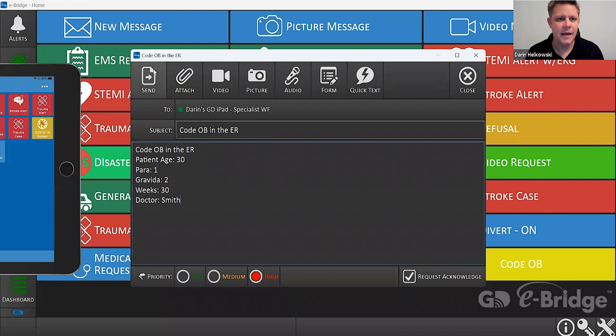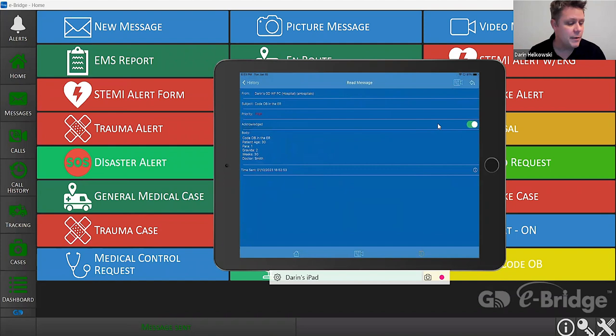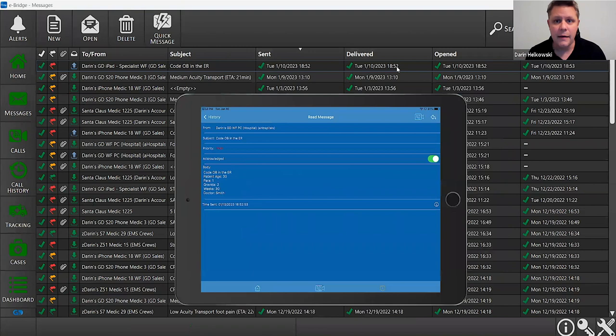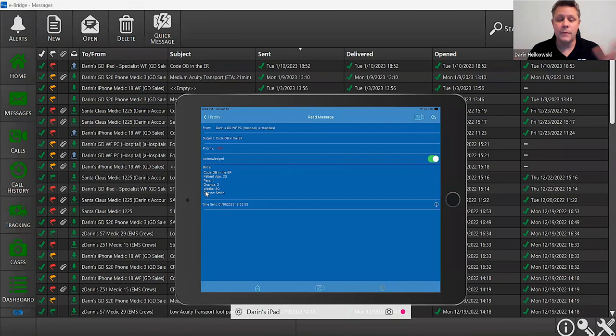I'll hit the send button and watch as it immediately comes through on the iPad. We open that message up and we can see the acknowledge button has now been acknowledged, which lets us know down in the ER that it was delivered, opened, and time-stamped when the acknowledge button was hit — a really nice feature so the sender knows the Code OB was received. The information entered is readily available.